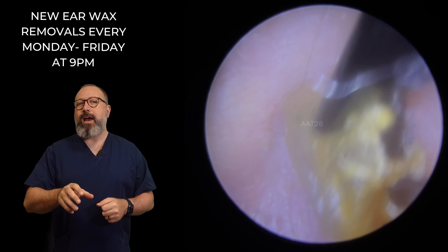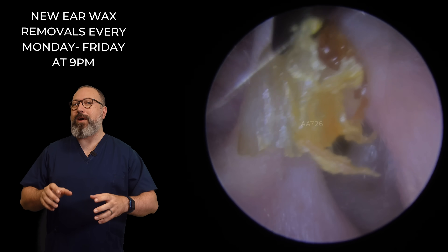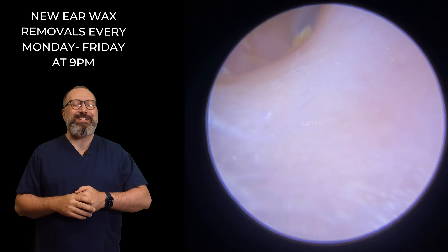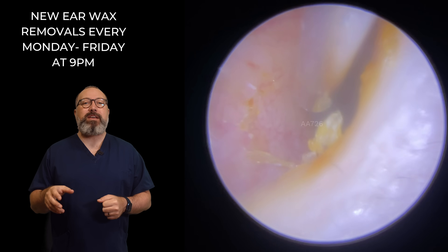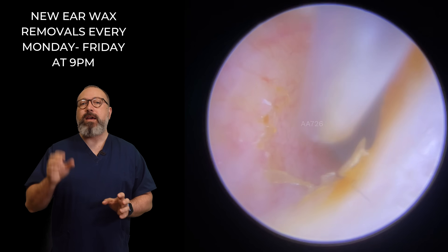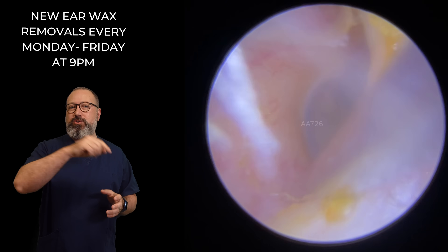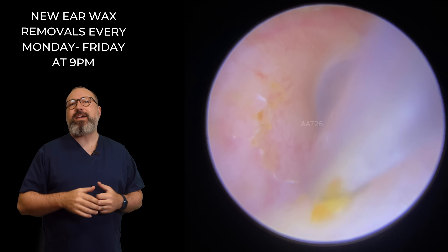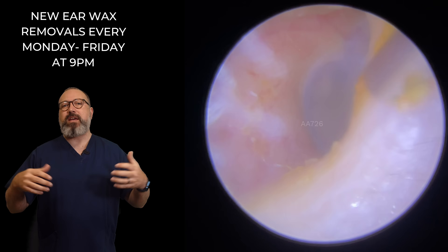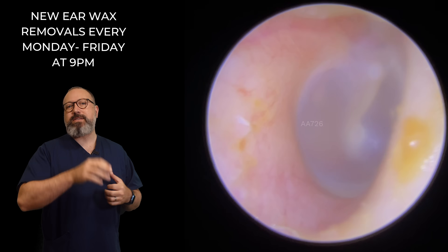I'm not going to throw too many technical terms in this one as I did overwhelm you just a little towards the end of the last video. There are a couple of things I want you to take away: lateral and medial is the first. The fine end of the forceps is great for taking away these little bits of skin and drier debris.